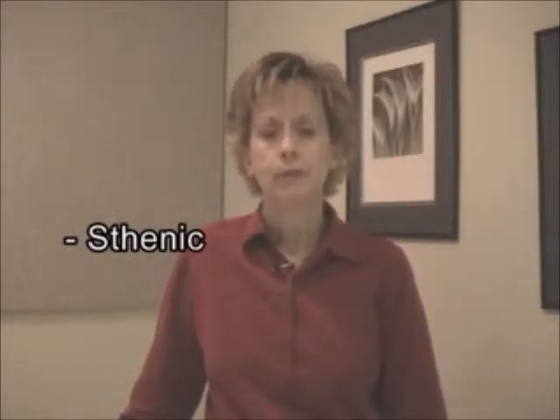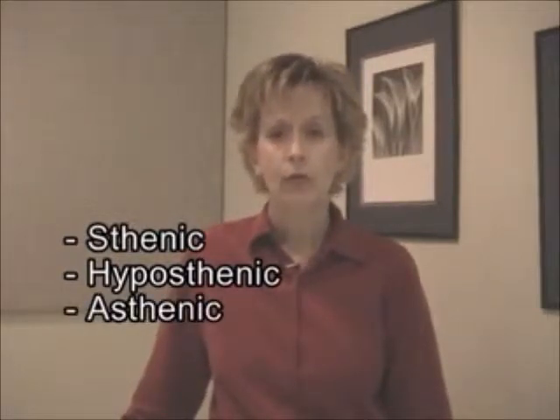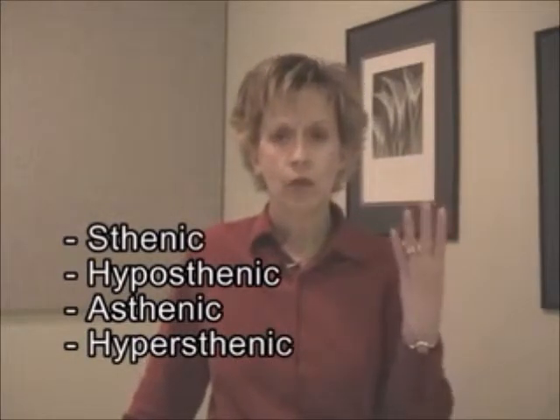So not only are you going to be dealing with different scenarios, it's patient habitus that is going to be probably your biggest challenge. And our 4 categories of patient habitus deals with sthenic, that's the average patient build. You have hyposthenic, which is a smaller than average build. You have an asthenic build, which is very tiny or very petite, especially if the patient's elderly. And then you have the hypersthenic, which is an obese type of patient. So again, 4 different types of body habitus, sthenic being average, hyper being excessive to normal, hypo just under average, and asthenic is very, very tiny. So when I do the demonstration today, I will be emphasizing those different body habituses.